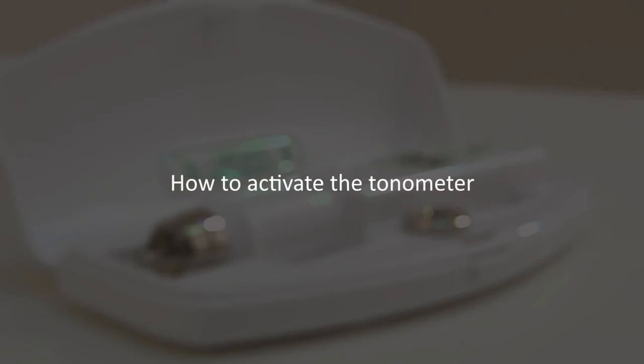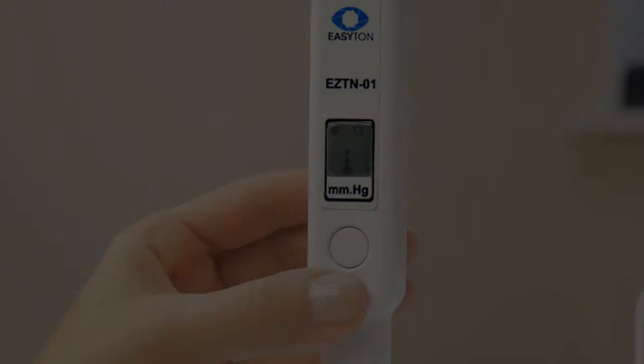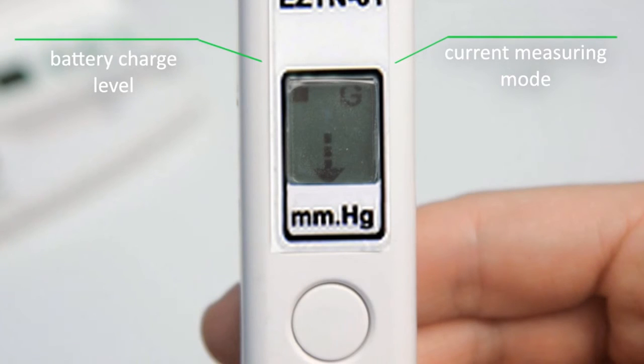How to activate the tonometer. Shortly press the ON-OFF button to switch the tonometer on. When activated, the tonometer makes a beep and displays a moving arrow on its display, which is a signal of its readiness for measuring. The G or M symbol in the top right corner of the display stands for the current measuring mode. The indicator in the top left corner shows battery charge level.